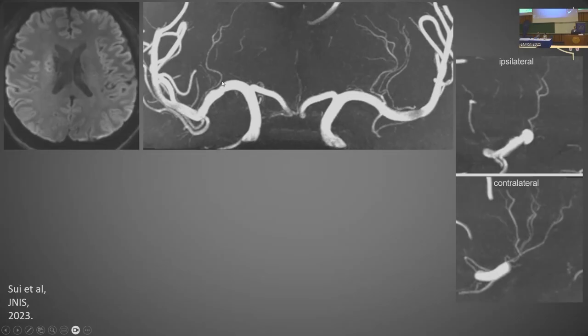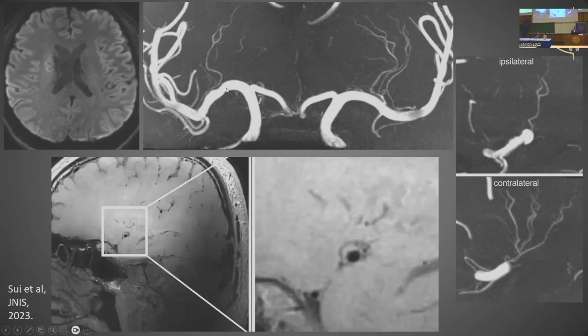And you see that little, again, indentation along the superior aspect of the MCA. This would not be called as a stroke etiology, and it also would be very tough for a radiologist to prospectively detect that little indentation. When we do the vessel wall imaging, you can clearly see that there is an atherosclerotic plaque along that superior aspect of the MCA, which is the reason why these perforators are getting picked off and why you're developing ischemic changes here.